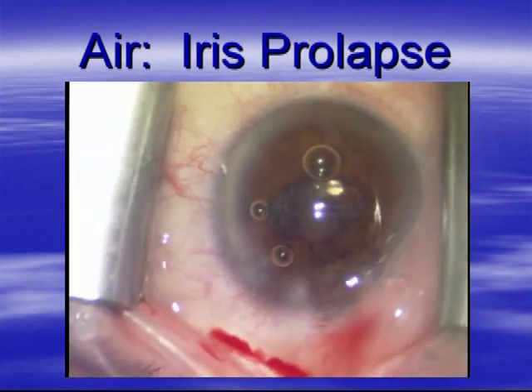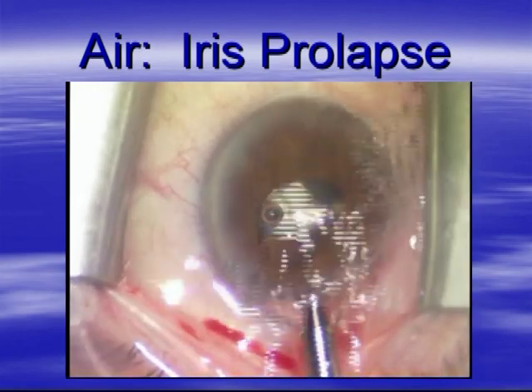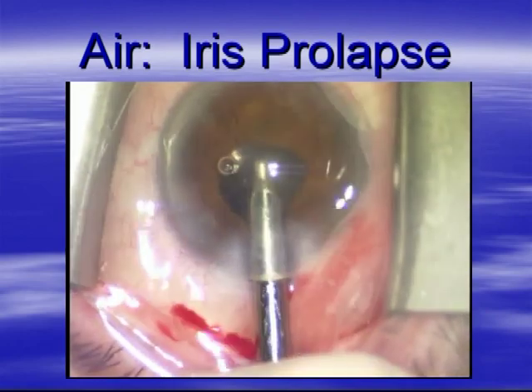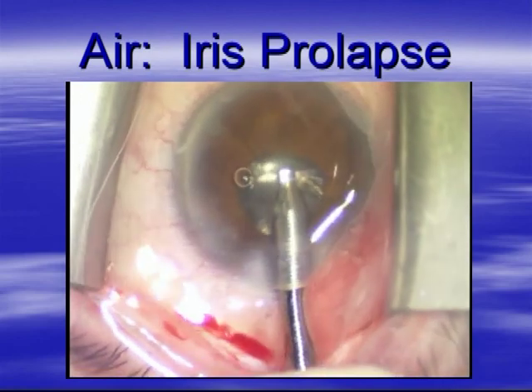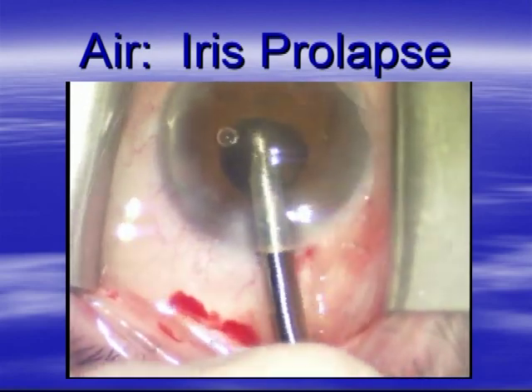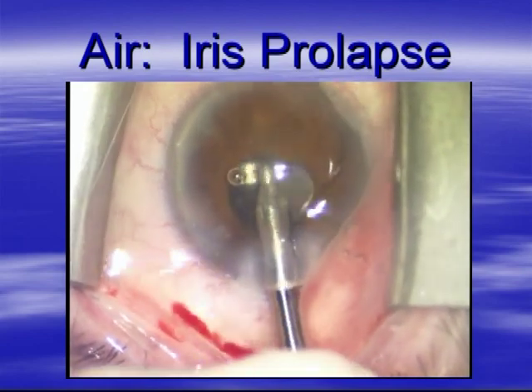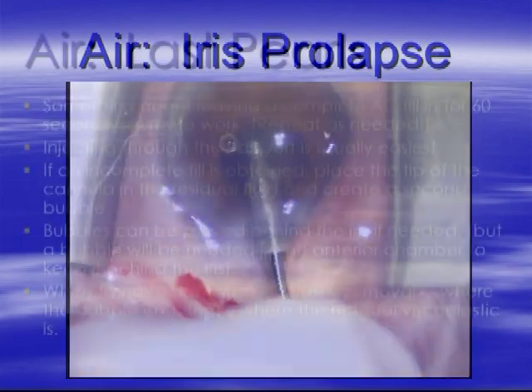So here we have the automated INA handpiece, and the tip goes in this time. The iris lets it go right by. We're going to get out the inferior cortical remnants first, then the superior cortical remnants. And again, the air bubble has been very useful in this case to deepen the anterior chamber and allow us to work around this floppy iris.